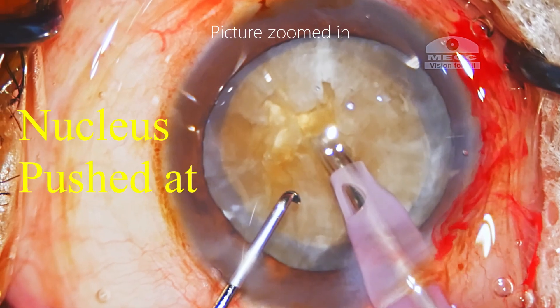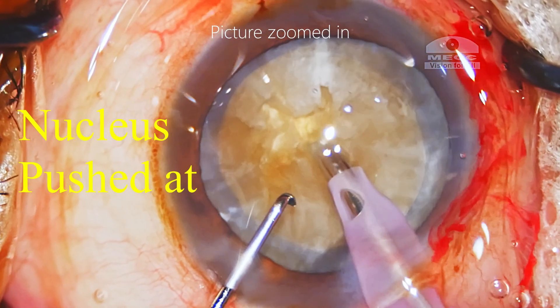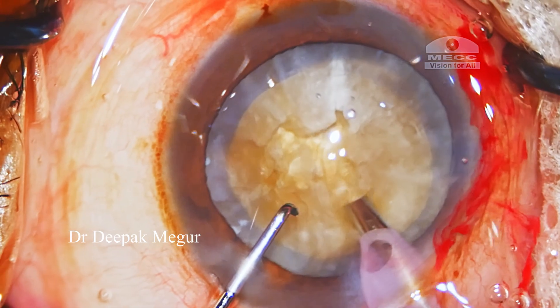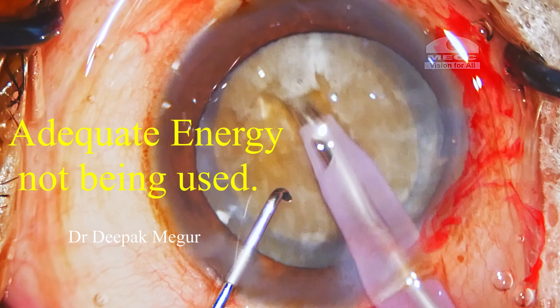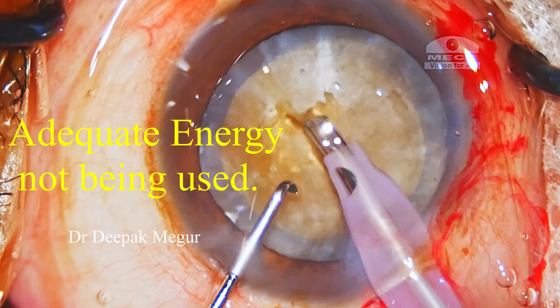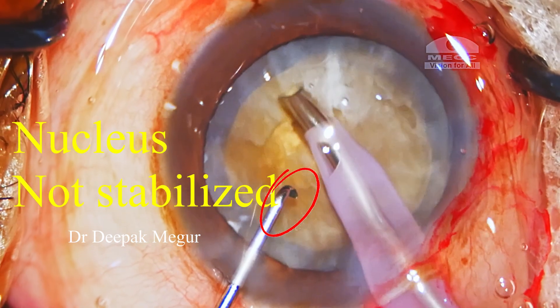For starters, we can clearly see that the nucleus is being mechanically pushed during sculpting. I can attribute two reasons for this error: the energy being delivered is not enough for this density of the nucleus — either the energy set on the machine is low, or the surgeon is not pushing the foot pedal completely down, which is what is required for this density of the nucleus.